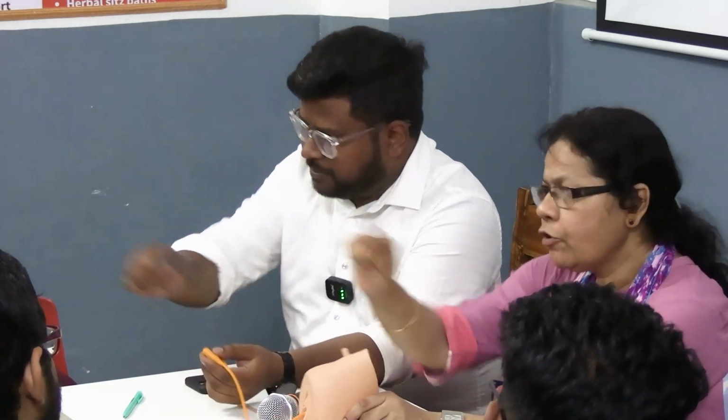Here you will connect this to a urobag. Basically there is a pipe connected to the urobag. You will see all the patients have a urobag attached. Okay? It measures the urine output.